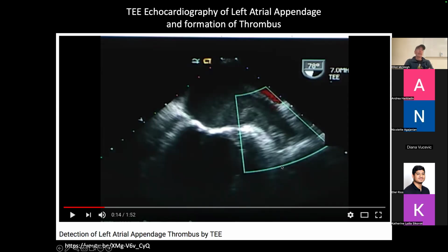So this is where image quality really matters, right? So it's like, what is the downside of my image producing a false negative? I remember they all seem kind of sort of up in the clouds. I got a false positive, true positive, false negative, true negative. And I got all these statistics. It didn't seem like it really meant anything to any human. A false negative for this human is a big deal because you missed it.